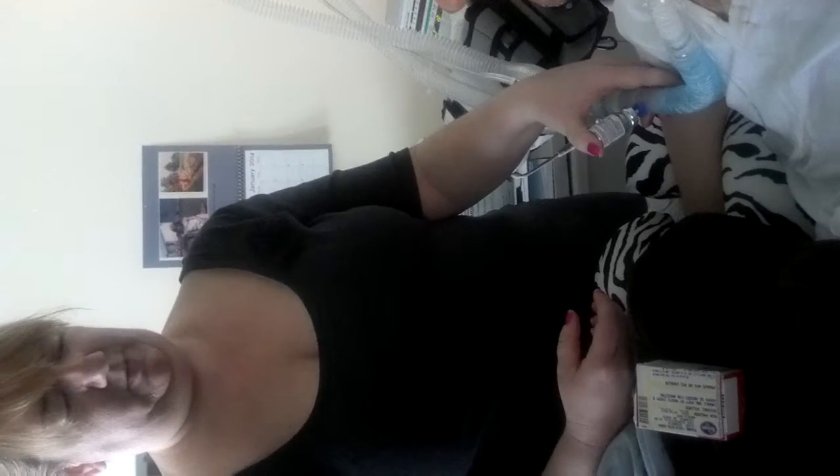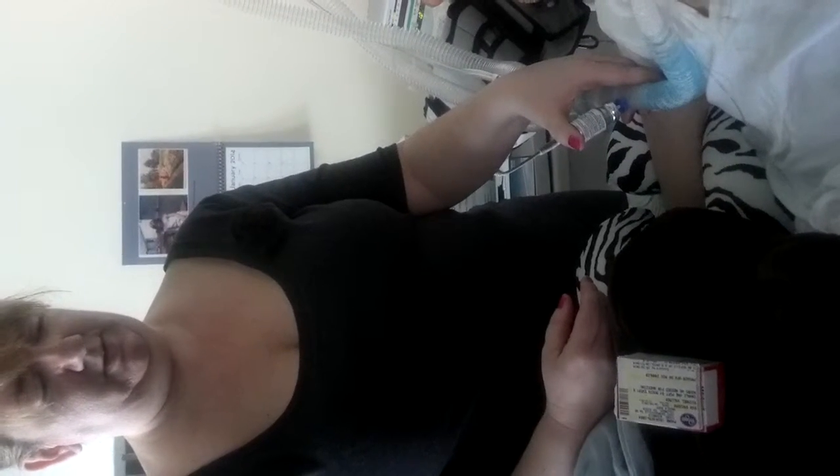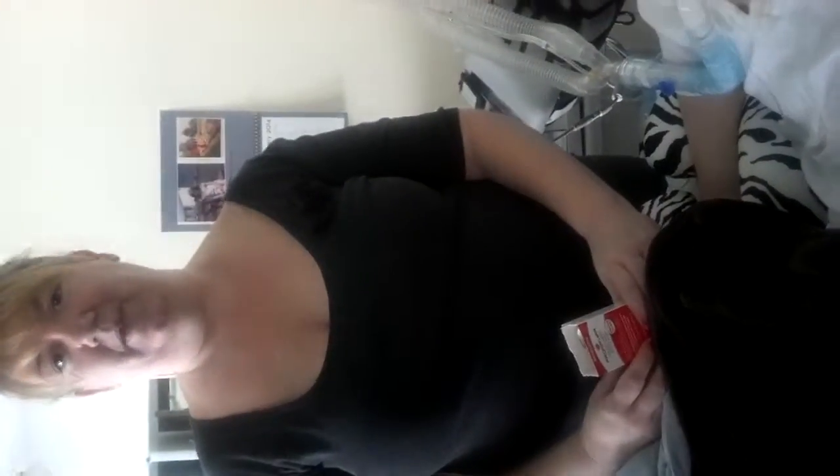Down, up. Wait a few more breaths. Generally, I wait about 15 to 20 breaths in between puffs. So, down, up. And since Mike is set at a rate of 24, it's consistent — there's a pattern you can tell. So if you have a patient that's breathing on their own and the vent's set for BiPAP, you have to time it by watching the chest rise and fall. But the ventilator is set for 24, so it makes it really easy to deliver it at the right time. That's it.